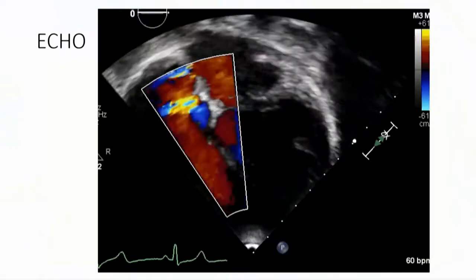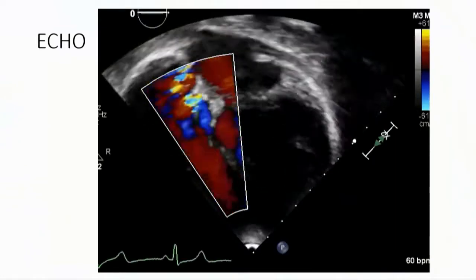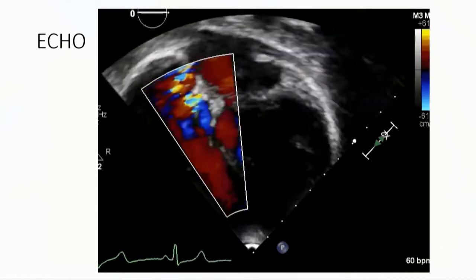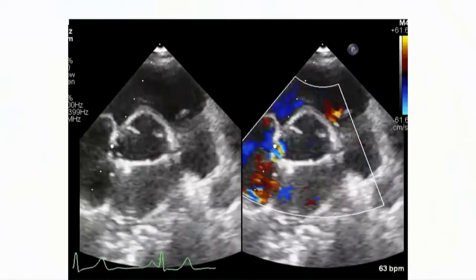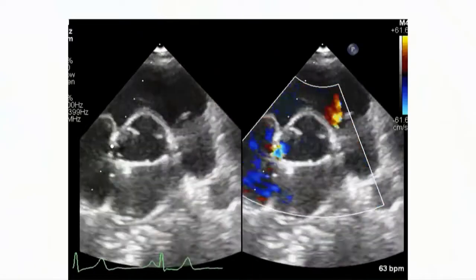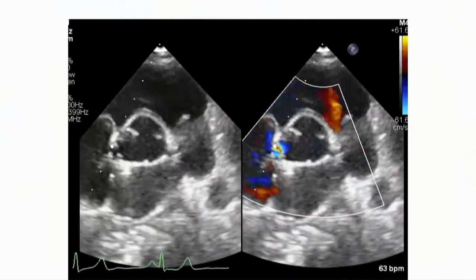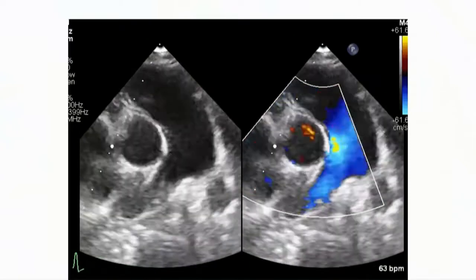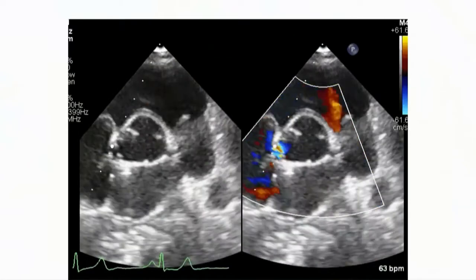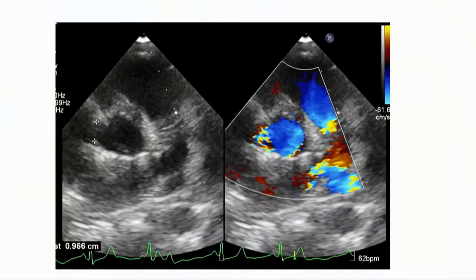This is the apical five-chamber view showing an abnormal connection between the aortic root and the RA. In the short axis view, we can see a connection from the non-coronary cusp to the right atrium — so it is an RSOV from the NCC to RA. The measurement is around 9 millimeters.